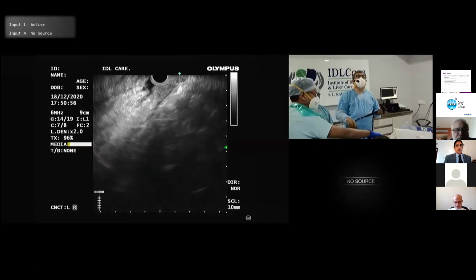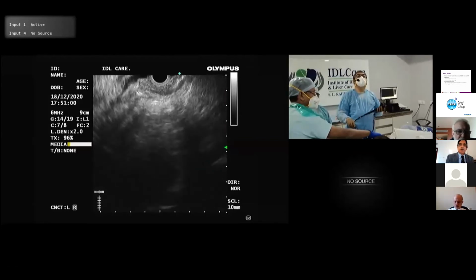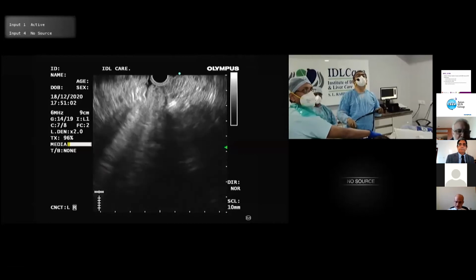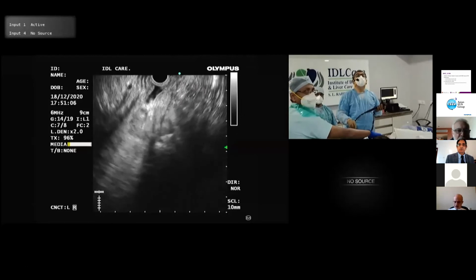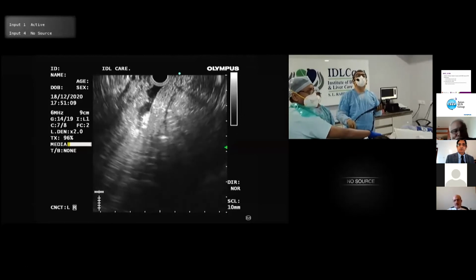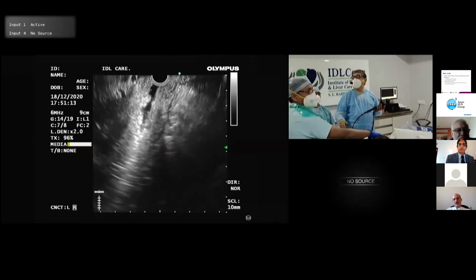So you see here gastric wall. We have to also see if we are thinking of gastrinoma, whether the wall is thickened. Doesn't look grossly thickened, mildly thickened. Freeze. Freeze karo bhai.